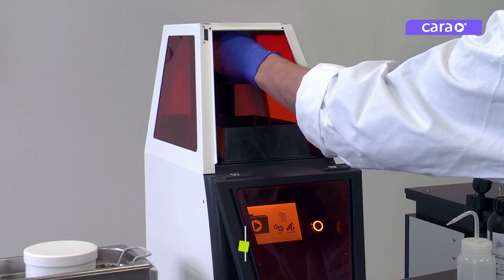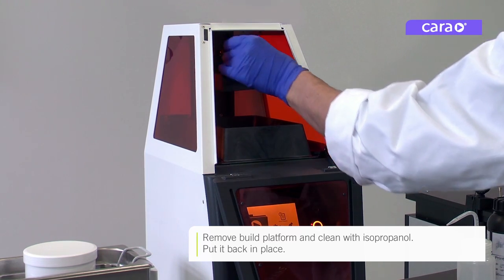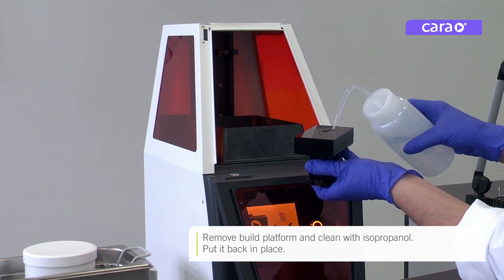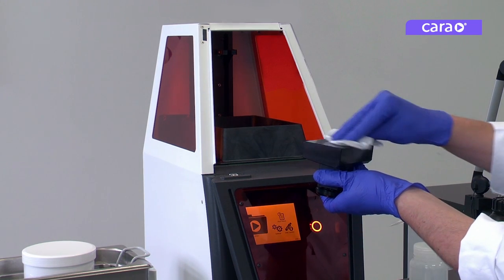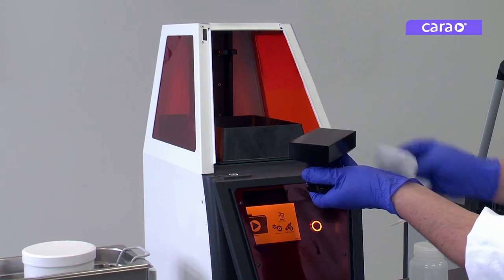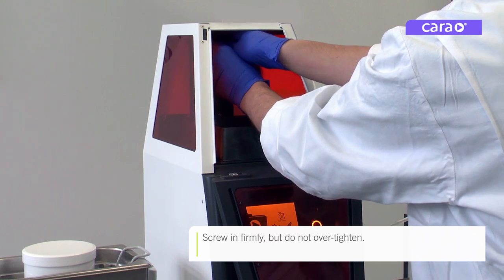First, remove the build platform and clean it with isopropanol. Then place it back inside CaraPrint 4.0. Screw the knob firmly but do not over tighten.